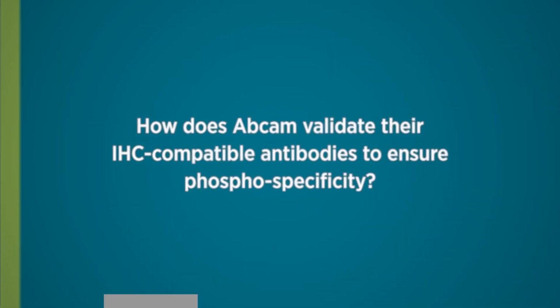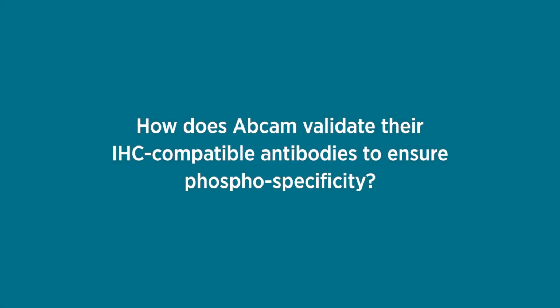Right. So if we can get a good positive and negative control in there, whether that's cell specific or we can do overexpressors, etc., we will try and do that, usually in the earlier phase. So we'll do an alkaline phosphatase test, so we'll do it on section. We'll do alk phos, we'll knock it out. So it's phospho specific in the sense that we know it's definitely a phospho. Exactly. Right. So we're not going to the level of it. We know it's a phospho 229, whatever.